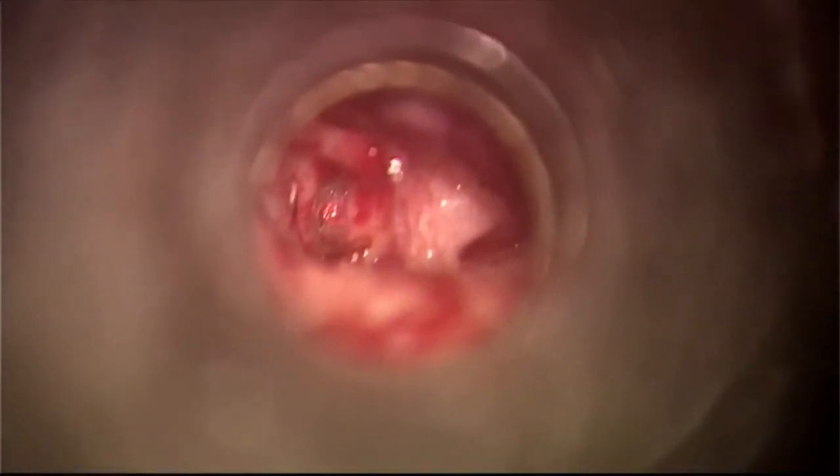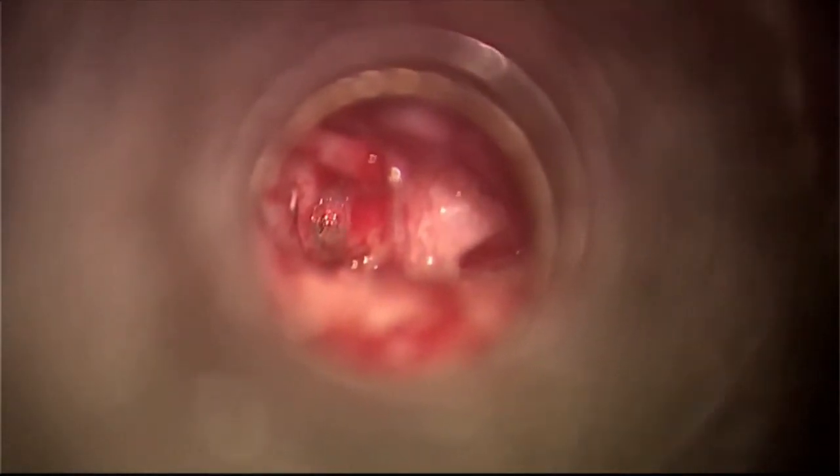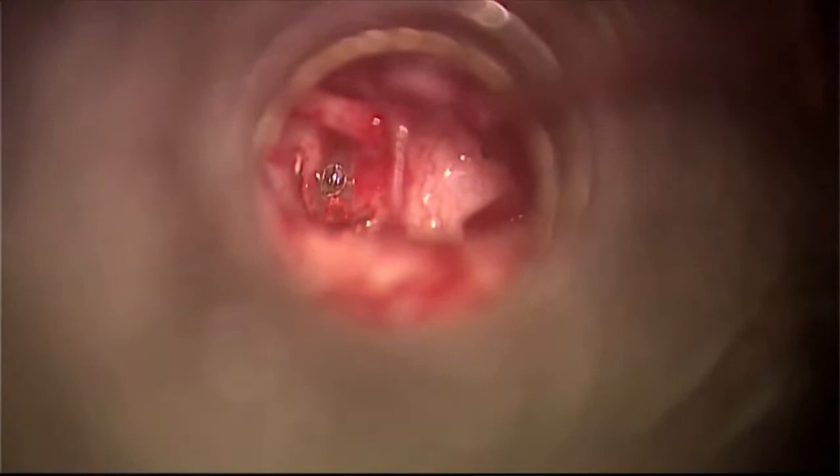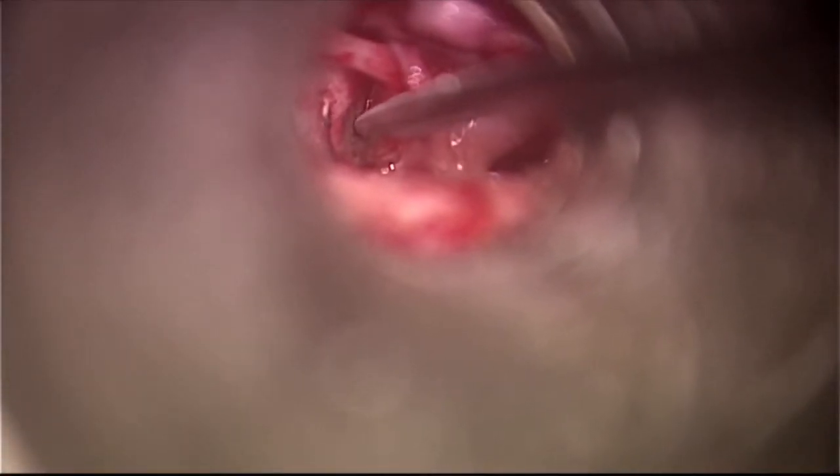See my fenestra in the lower part, in the center. See this? Ready? See now. Finished. Pick that. We'll remove this. Chapter closed. Perfect. See this? So simple. This is the beauty of that laser, without mobilizing anything. Even if it was mobilized, the laser would still work beautifully.